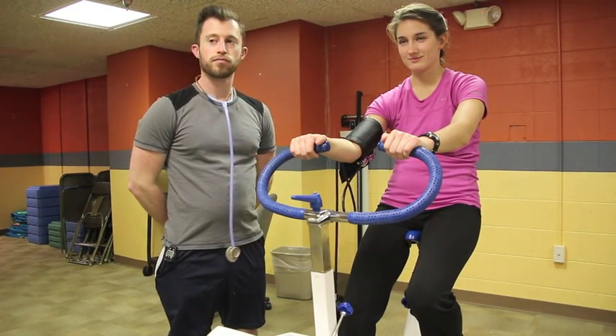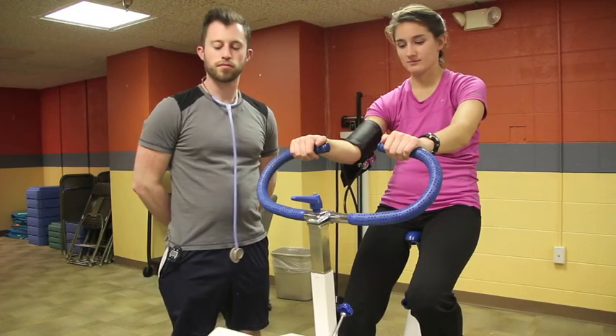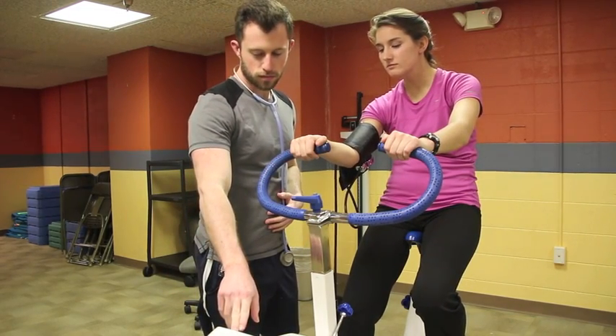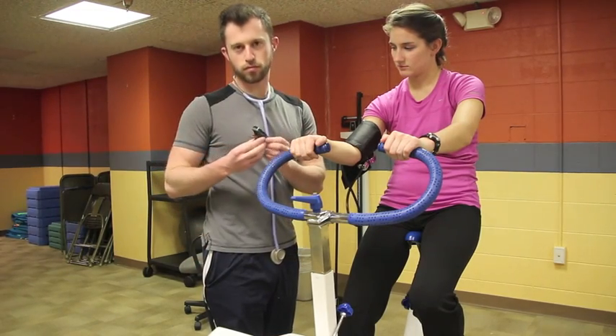When performing this test, the client must pedal at a steady rate of 50 RPM, or if using a metronome, 100 times per minute.